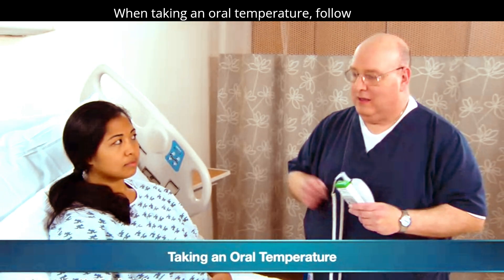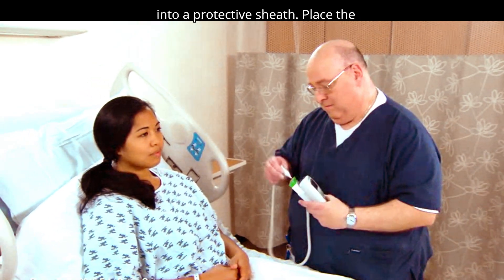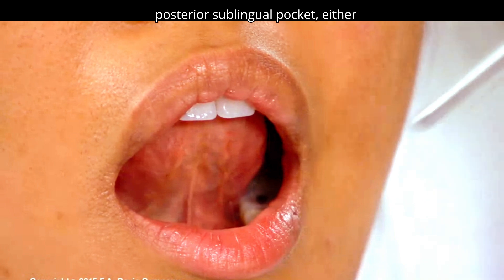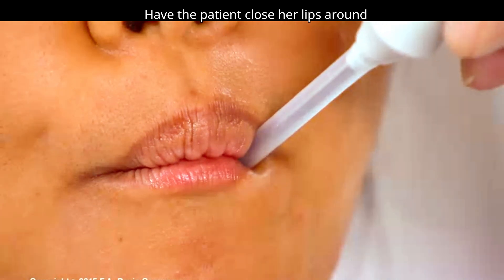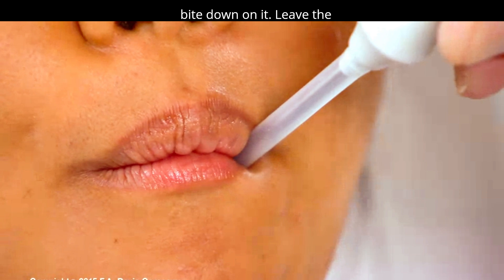When taking an oral temperature, follow these steps. Slide the thermometer into a protective sheath. Place the thermometer tip under the tongue in the posterior sublingual pocket, either right or left of the frenulum. Have the patient close her lips around the thermometer, cautioning her not to bite down on it.